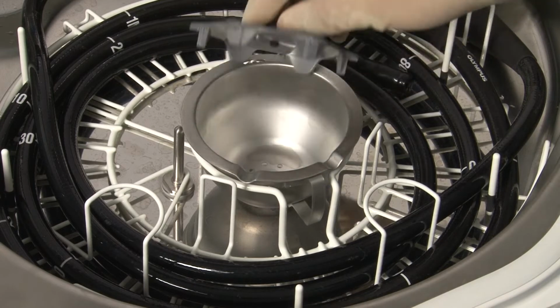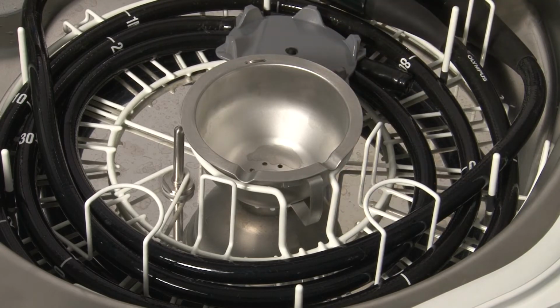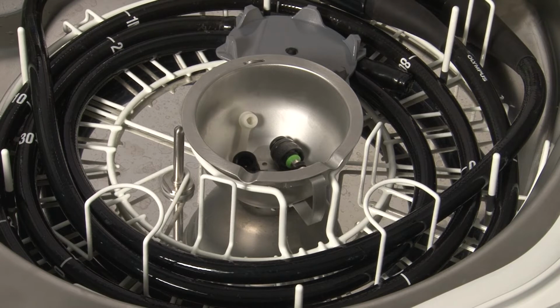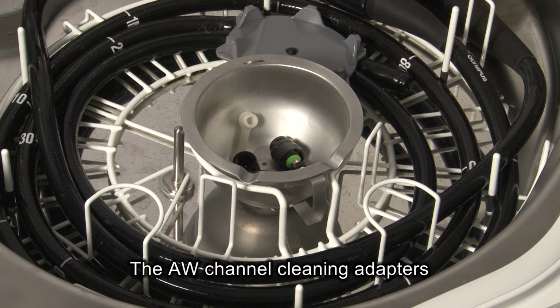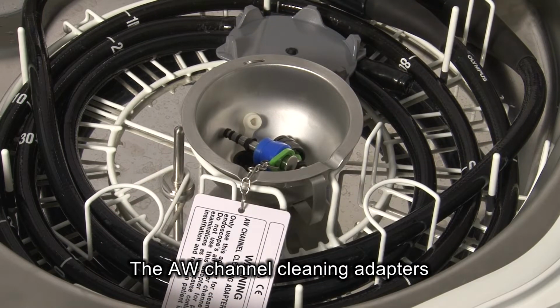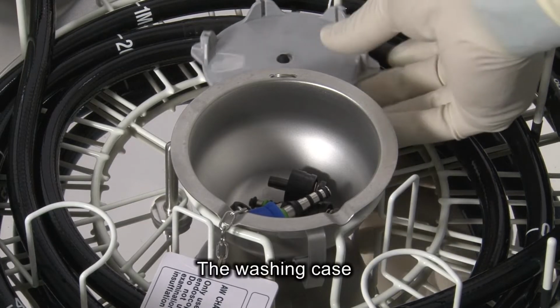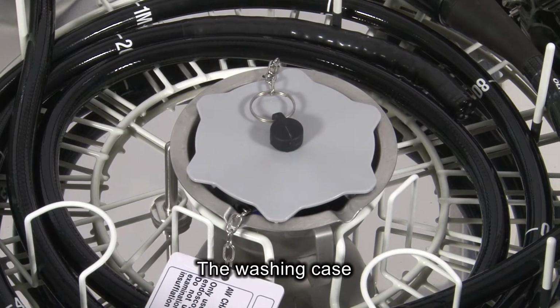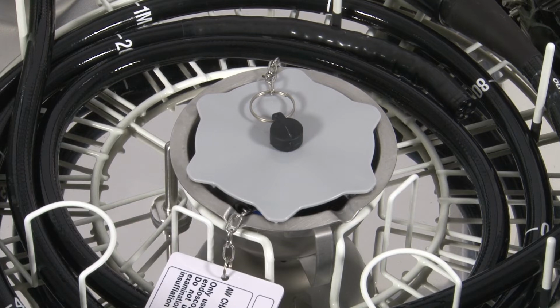Put the biopsy valve and other accessories in the washing case. Make sure to open the biopsy valve and disassemble the other accessories that can be disassembled. Put the main bodies of AW channel cleaning adapters in the washing case and place the indicator plates outside of the washing case. Close the washing case cover so that the chains of the AW channel cleaning adapter are not caught between the case and the cover. Place the chains of the adapter in the notch of the rim.